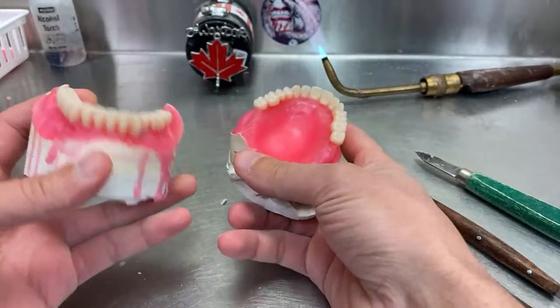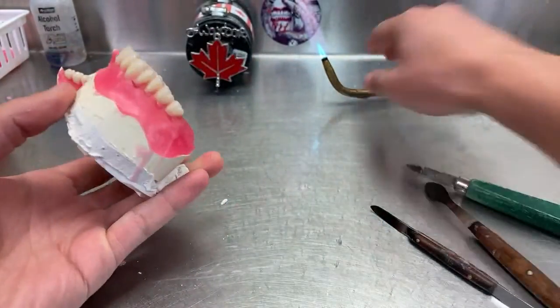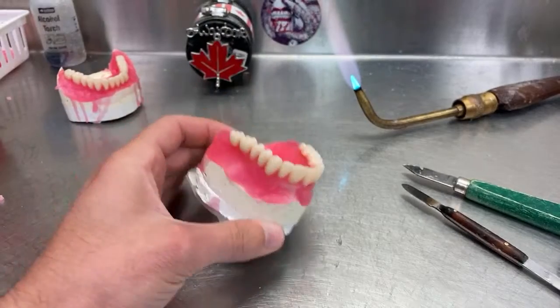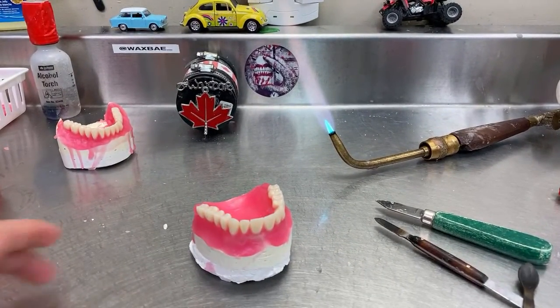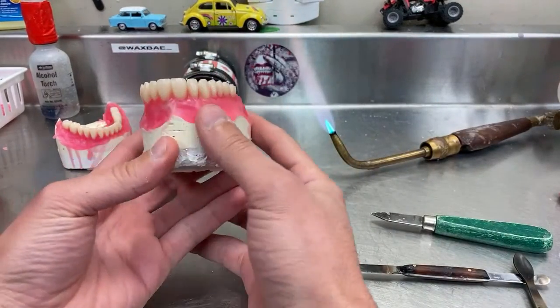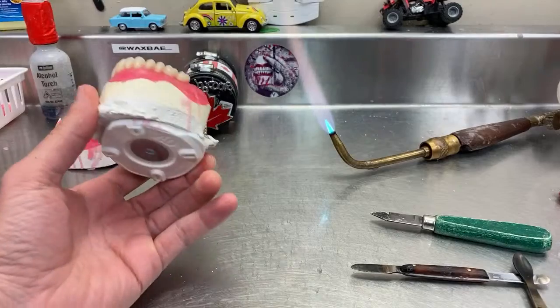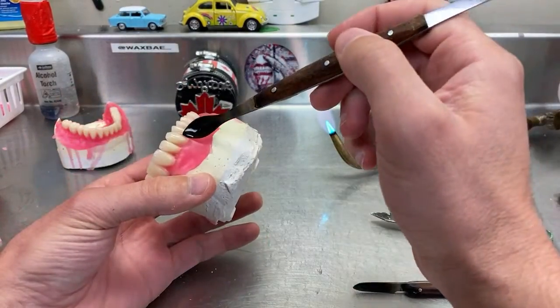Looks good. All right, upper. We got two uppers. So an important thing here is to heat up the wax, because I said this in the morning, it's very cold here. What happens is that when the wax gets cold and you put another layer on, you cannot add more wax to it because it will delaminate.